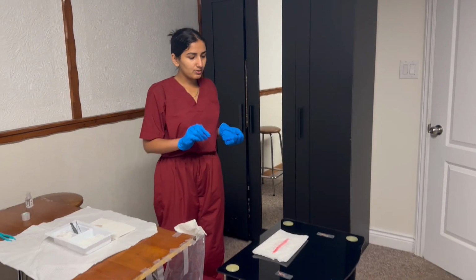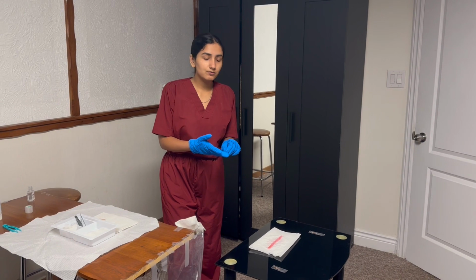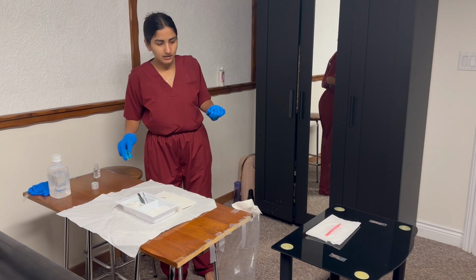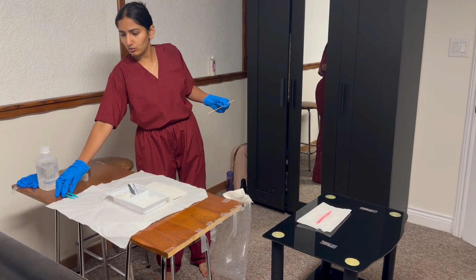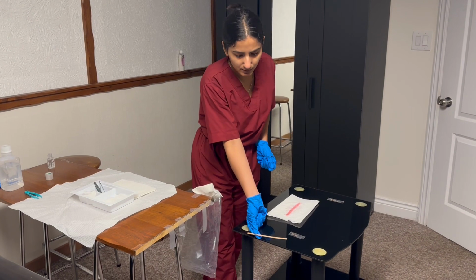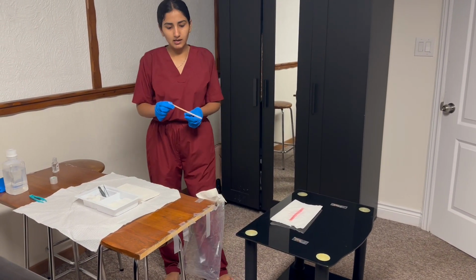So now I am going to assess the wound. As I can see, it is an abdominal wound which is closed with sutures, which I can count are 10 in number. And now I am going to check its length. And also there is no width and no depth of this wound because it is closed. So I will only check length. And I will match it with my scale, which I can see is 9 centimeters in length, and I will throw it.